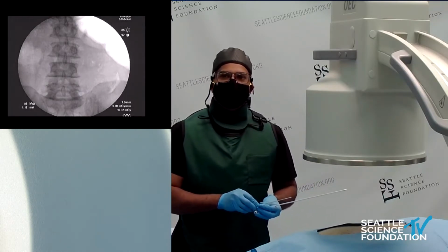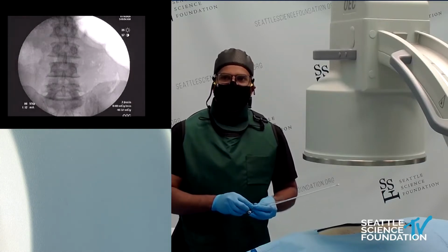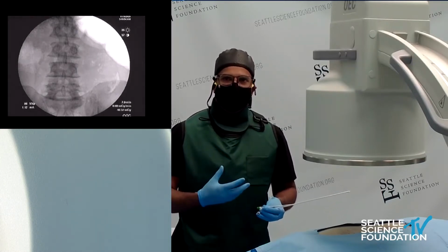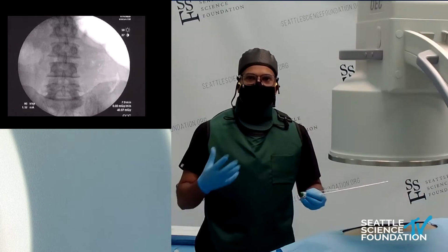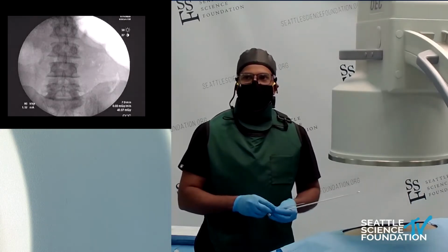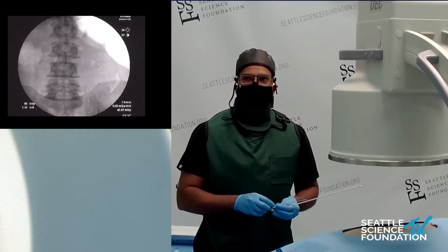With DRG stimulation, you're much more focused, and you see robust changes not only in the patient's perception of pain, but also in their sympathetically maintained signs and symptoms. You can see literally in the recovery room their color change and their swelling reduce. It's really quite remarkable, the impact that DRG stimulation has on the vascular system and the sympathetic system.